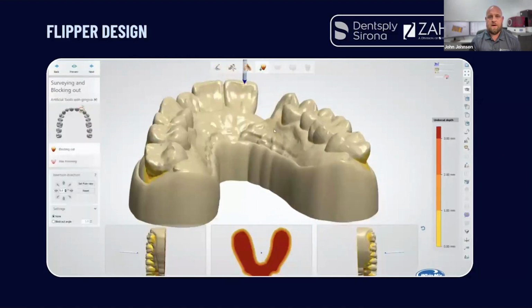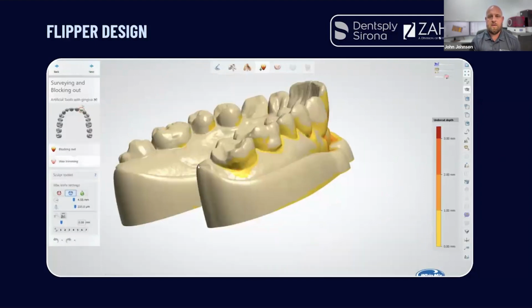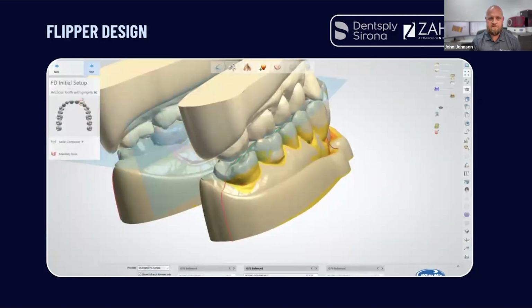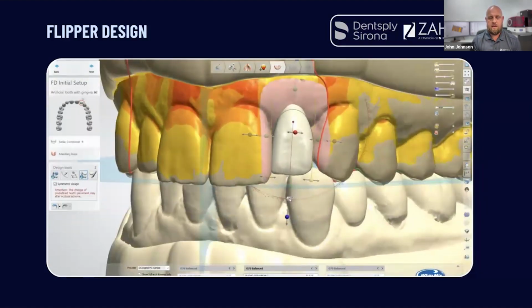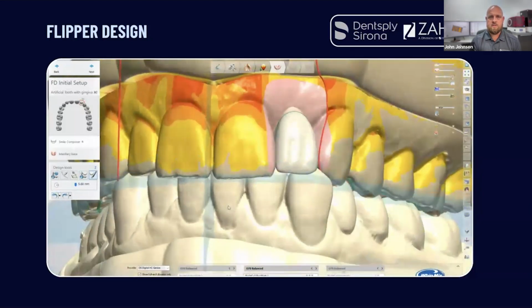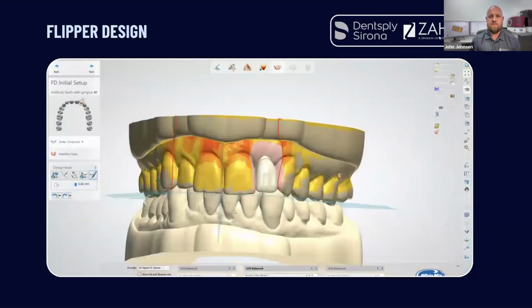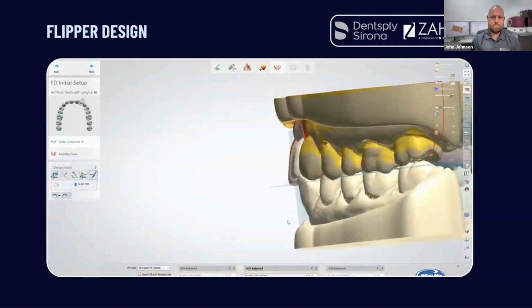The one thing I really like about doing flippers digitally, it seems like a lot of work for the money sometimes, but your print accuracy, like you could see this one had very little undercuts. Your print accuracy really helps a ton when you've got very little undercut because the fit is so accurate. Also, I can manipulate this denture tooth like it's crown and bridge if I want to. It's a little bit different than going to the tooth counter, finding a tooth that'll fit this flipper, and grinding on it. It's just a lot easier to manipulate.